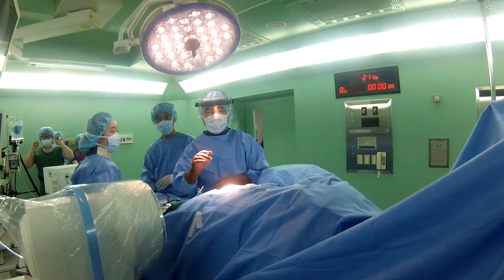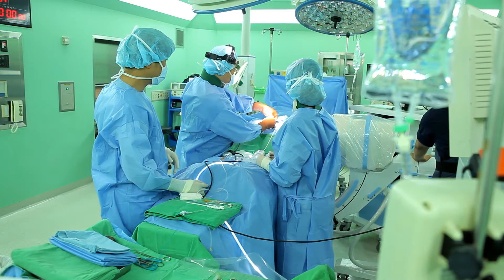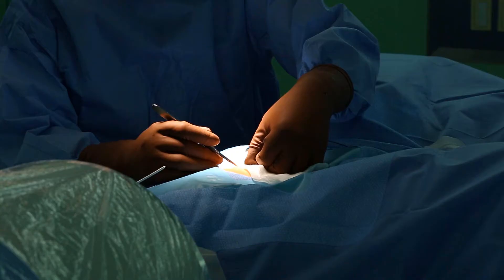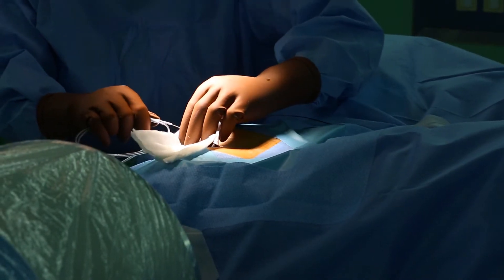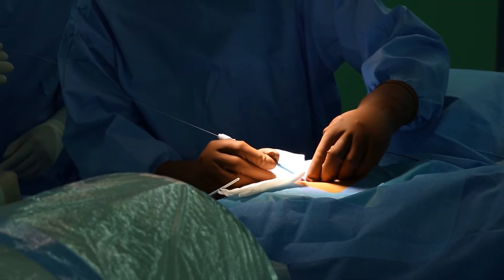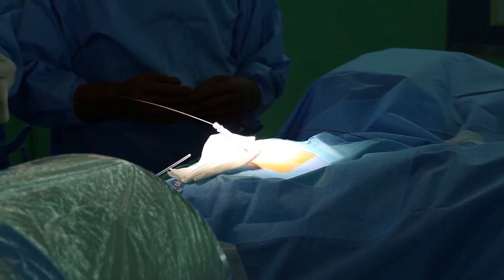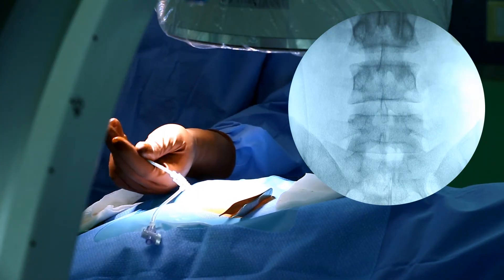You can see the approach procedure from puncture to get to the target point. This part is the important process on which a successful operation depends. Look for the appropriate place to puncture in the area of the hiatus. Inject local anaesthetic in the area of the hiatus. An epidural needle is inserted into the epidural space of the spine through the hiatus above the coccyx. Place a guide wire into the hiatus through the needle. Remove the needle leaving the guide wire in the hiatus, then a dilator is introduced over the guide wire. Remove the dilator, then put the stylet and sheath onto the guide wire. After the stylet and sheath are placed in the hiatus, take out the guide wire. Remove the stylet leaving the sheath in the hiatus. Insert the catheter into the targeted treatment point over the sheath.